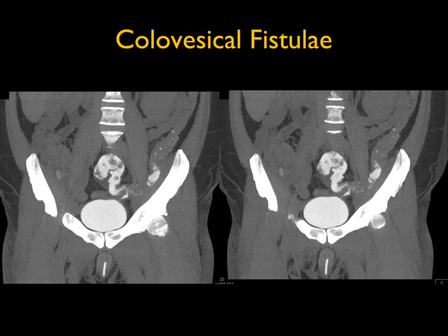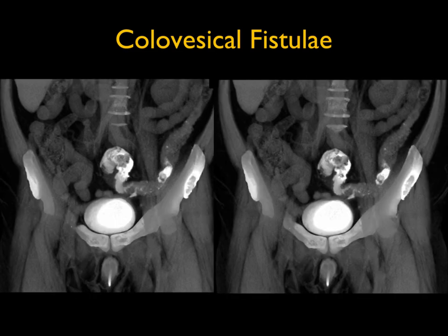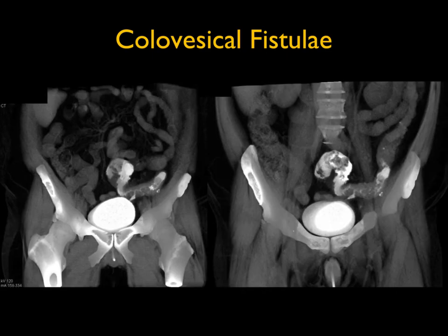A nice example shows the fistula tract from the patient's sigmoid colon to the bladder. These patients will need surgery, and even in the best of hands this has high morbidity and mortality. Colovesical fistula due to diverticular disease: fistulas on the right side are typically due to Crohn's disease, left side to diverticular disease.